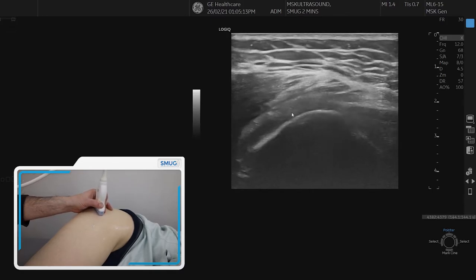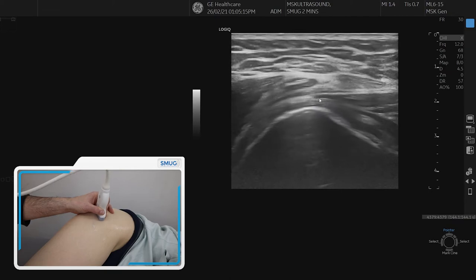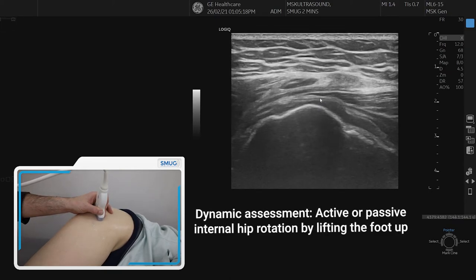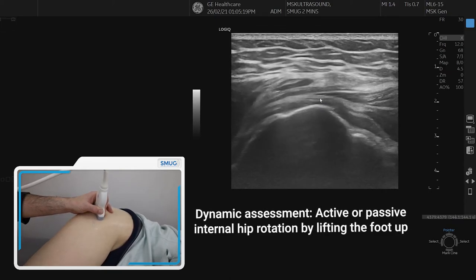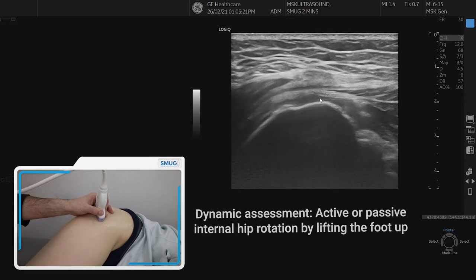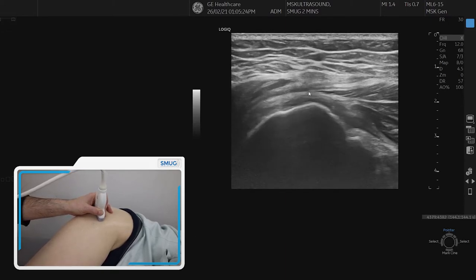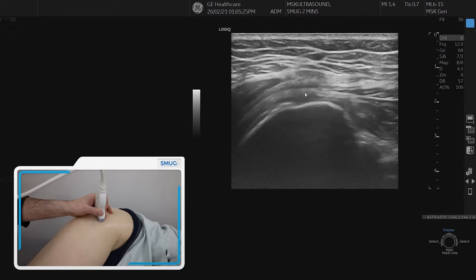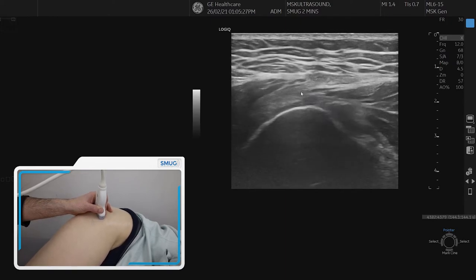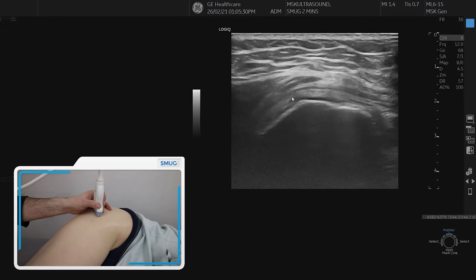So the main thing now is to do a dynamic test. We go back to the beginning and ask the patient in this position, lying on his side, to lift up his foot and go back — do it slowly so you can monitor and see what happens. In that plane between the two layers is where you would find some fluid, and you can follow that more posteriorly as the patient keeps moving.